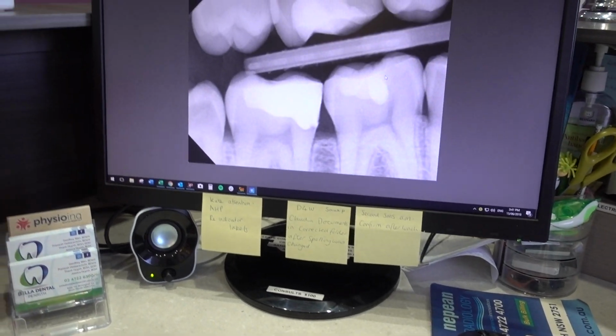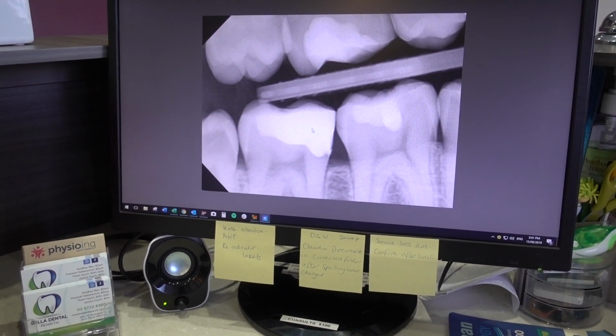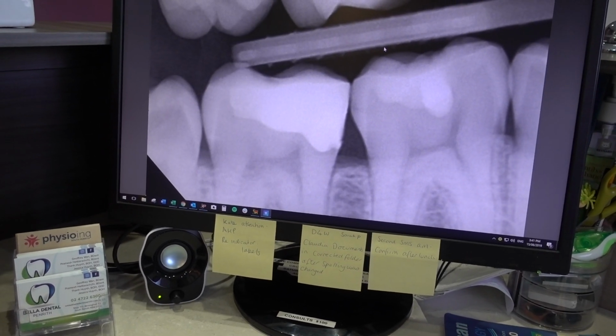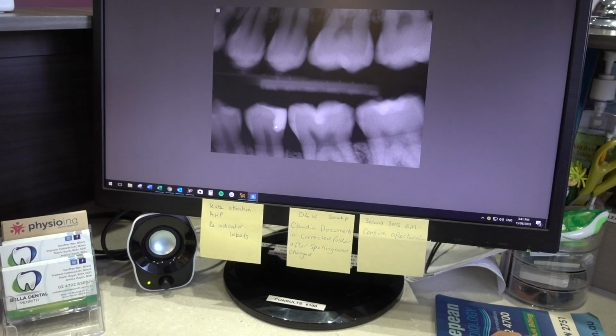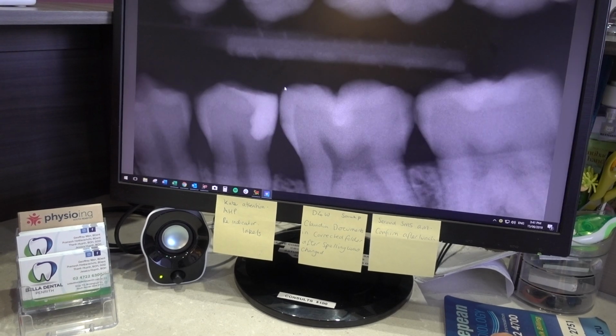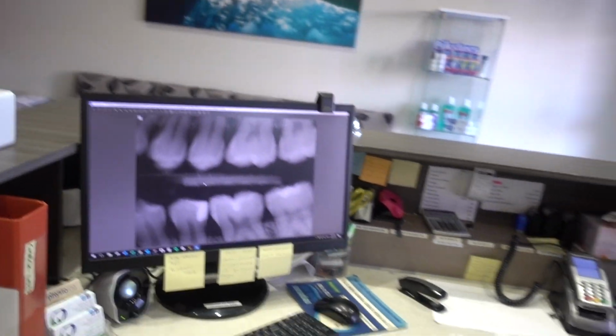Now, what I wanted to show you were the post-op x-rays that I've done for some of the restorations. I could quite honestly say that it adapts really well to the cavity preps. See that? Look at that margin. Of course, I wouldn't be able to do this without my old trusty V3 matrix kit. You can see these nice little contoured margins, these Tofflemire-esque flat margins.